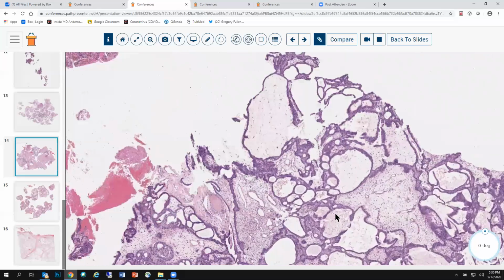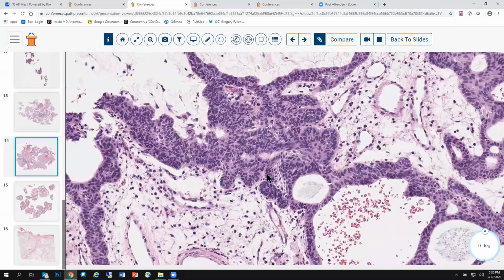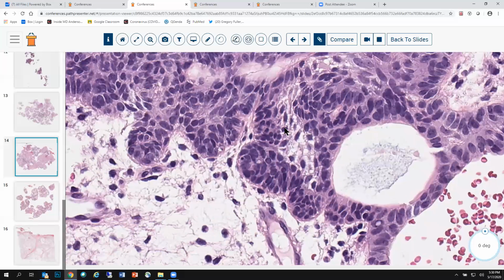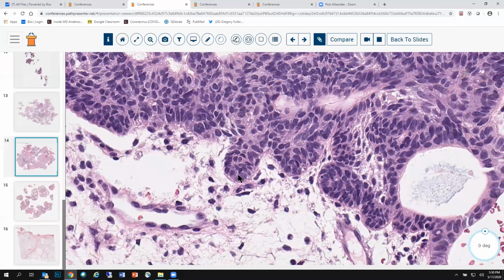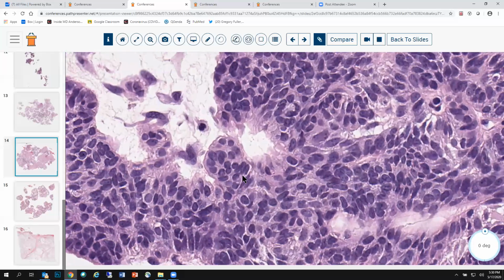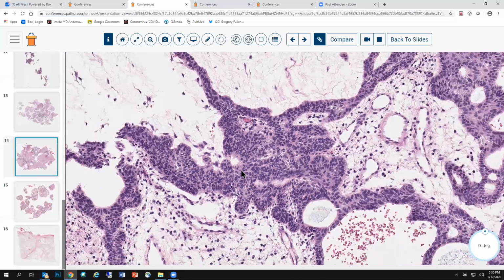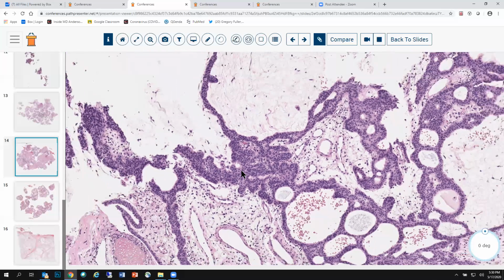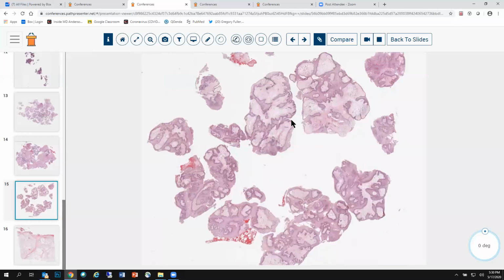One other really quick thing: when you run beta-catenin and BRAF V600E on these specimens, the beta-catenin is going to show beautiful membranous positivity in all of this epithelium, but that's a negative immunostain, right? You know that from other contexts. It's going to be the cellular whorls and the palisading edges that will show strong positivity in the nuclei of a subset of cells. It's usually a minority of nuclei that show the aberrant intranuclear translocation of beta-catenin, but they will be there if you have a large enough example. Okay, moving on to the next example.